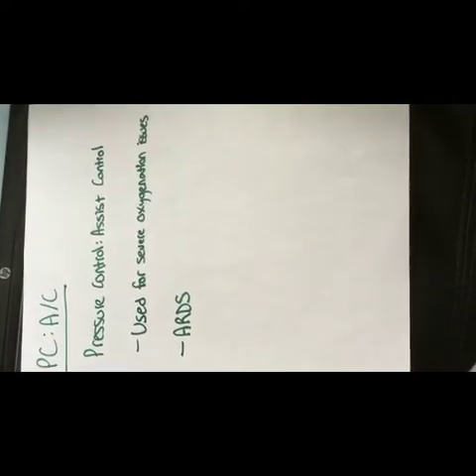This mode is used for severe oxygenation issues in patients with ARDS. In conventional volume ventilation, the 2 settings we use to address oxygenation issues in patients are the FiO2 and the PEEP level. When these methods fail in conventional volume ventilation, we need to examine why. Your patient may be going into flash pulmonary edema, or they may be going into ARDS.